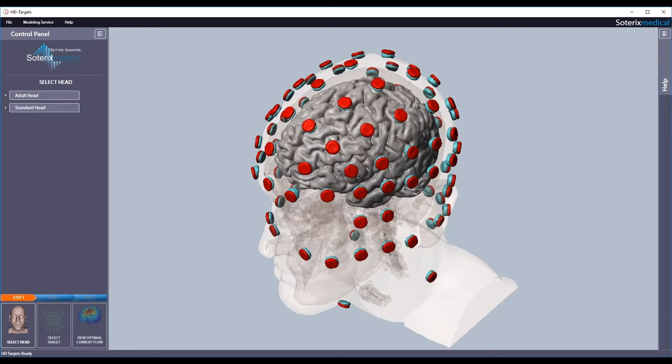This is a demonstration of how to use HD Targets by Soterics Medical. HD Targets is a simple but powerful program that allows you to achieve neuro-targeting with your Soterics Medical High Definition Stimulator.